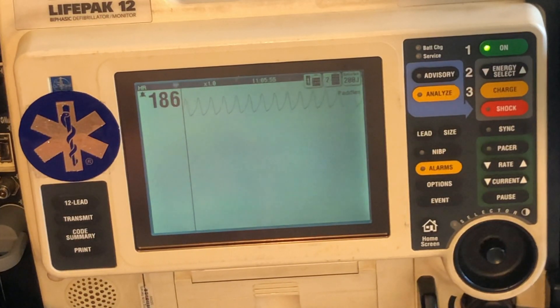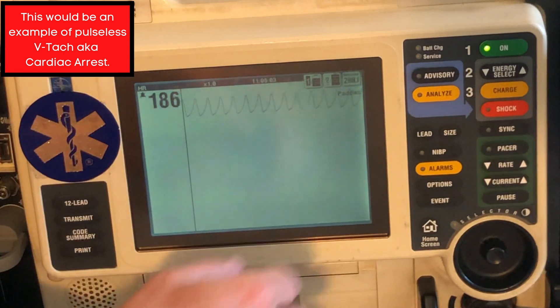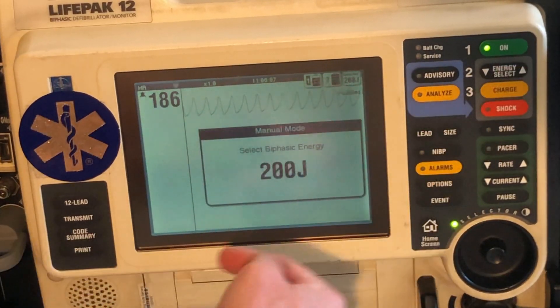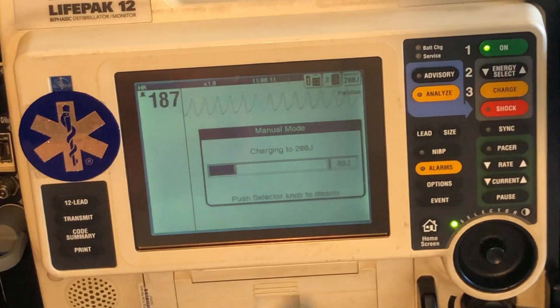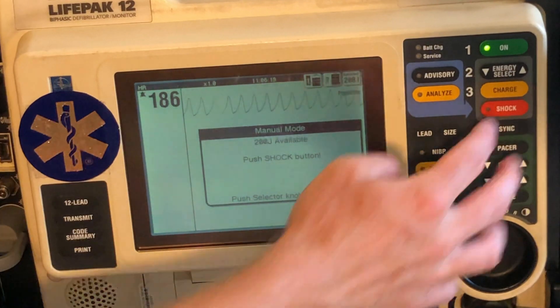So let's say this patient right now is in V-tach. What we're going to do next — I'm going to hit charge. First select the energy: 200 joules. I'm going to charge it up, and then you actually hit the shock button to do it.